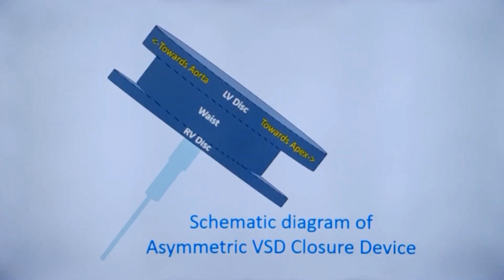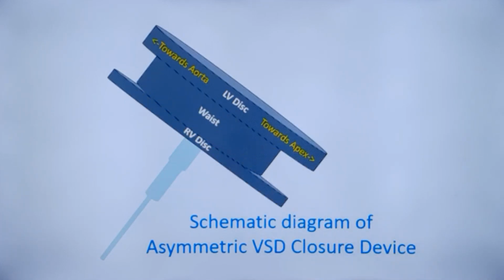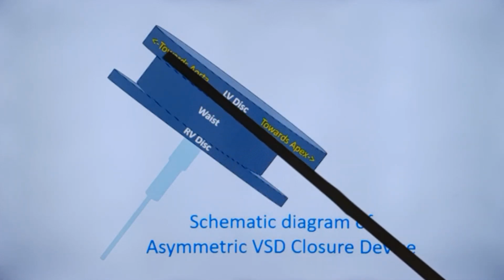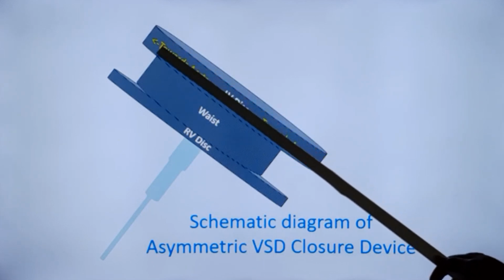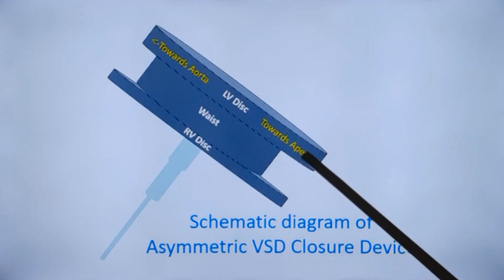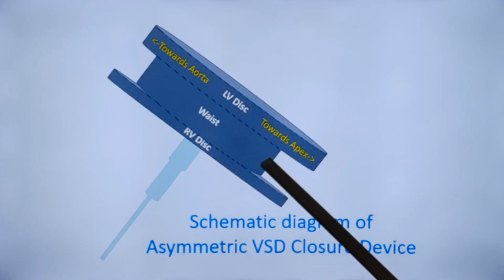As the name implies, this is an asymmetric device. This is the right ventricular disc which is symmetric, and this is the waist of about 1.5 millimeter thickness between the two discs, and this is the asymmetric portion. Towards the apex, the flange is about 5 millimeters, while towards the aorta, where impinging on the aortic valve is likely, the flange is only 0.5 millimeter.